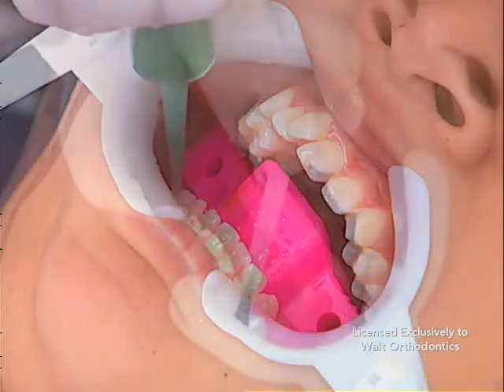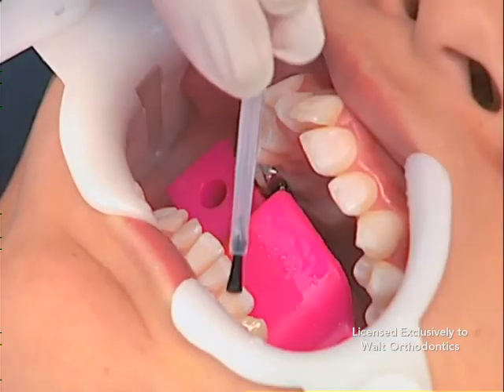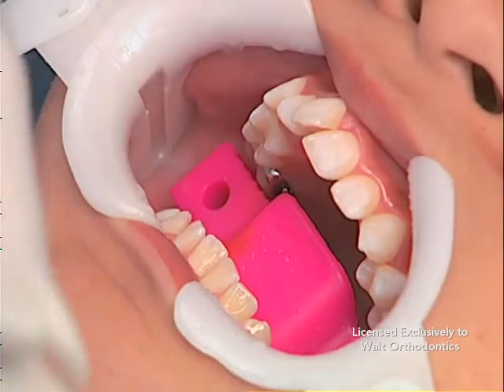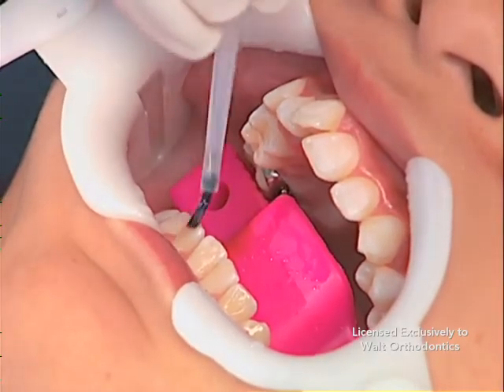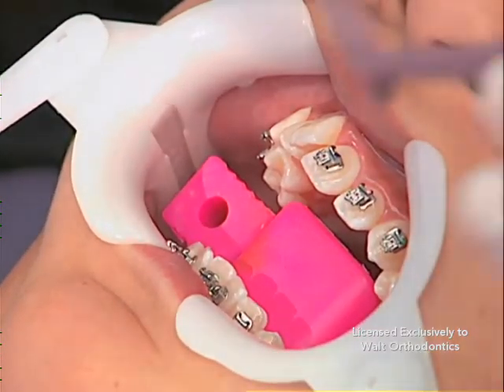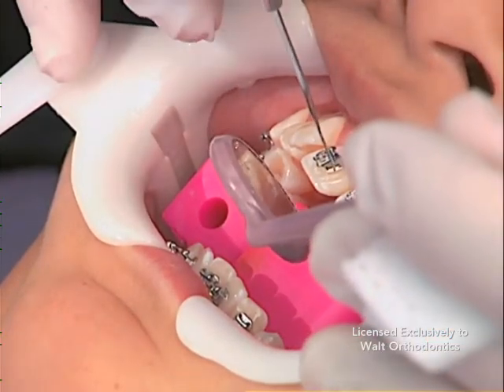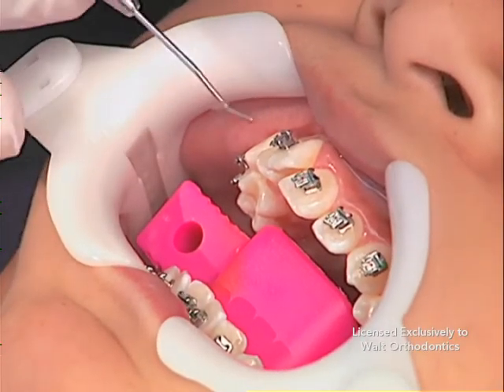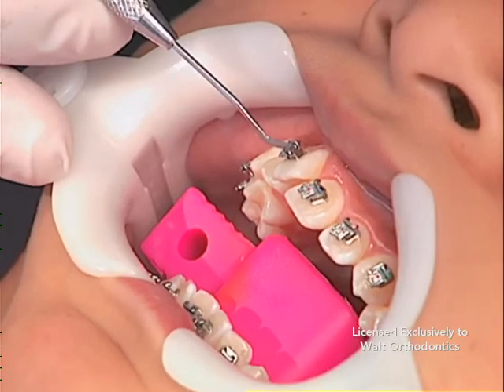A primer or sealer is then applied similarly to the etching material. This primer will react with a composite or bonding agent, which is then applied to activate the adhesives. Brackets are placed tooth by tooth in exacting position. Each can be measured to assure proper positioning. In most cases, the slot of the bracket is measured from the bottom edge of the tooth on each tooth.